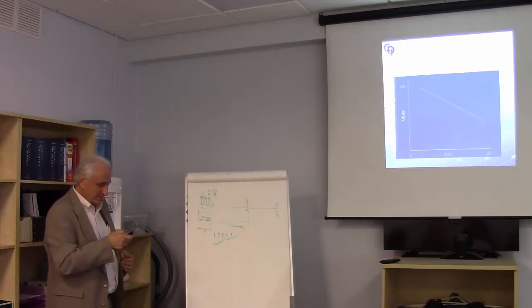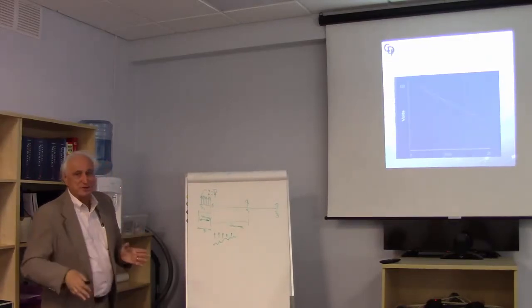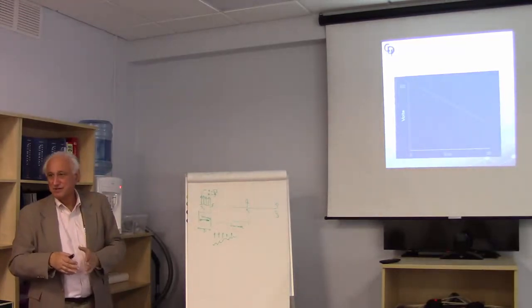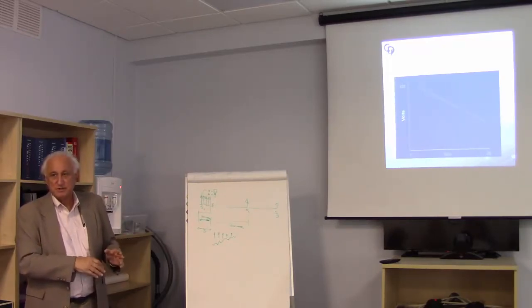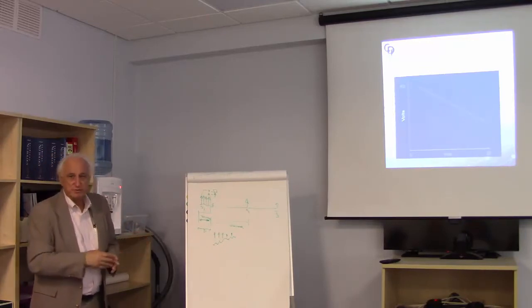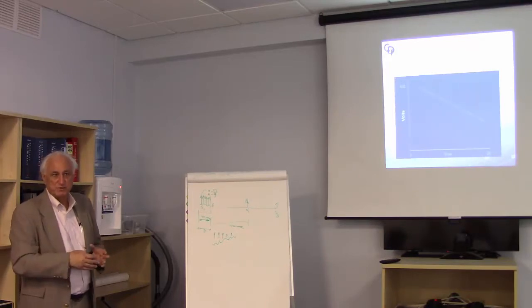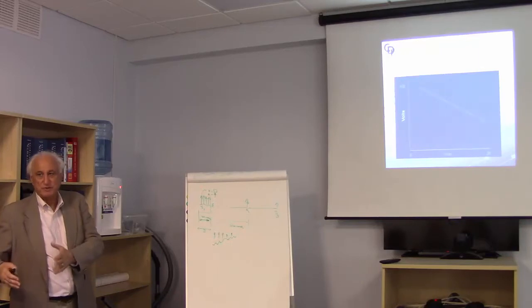Don't try to ascribe the numbers of this line to what may happen with any individual patient, but it's the general idea. If you're working with a child 1 or 2 or 3 years old, it's going to take a higher stimulus intensity to produce a motor potential than it will if you're working with someone who's 10 or 12 years old versus someone who's 30 or 40 years old.